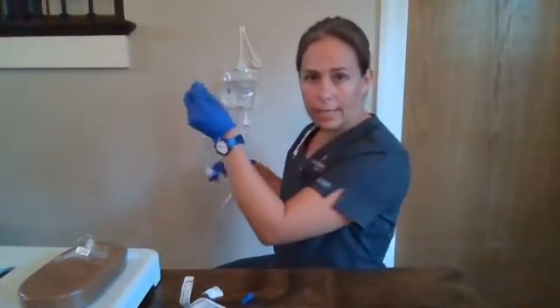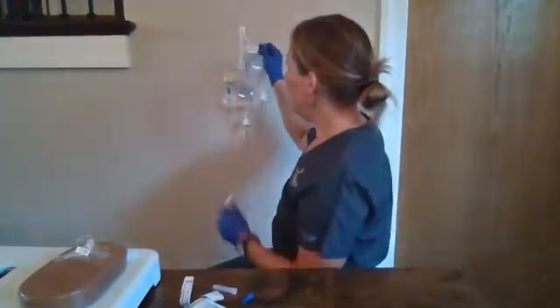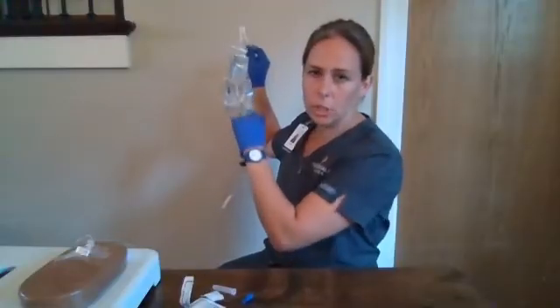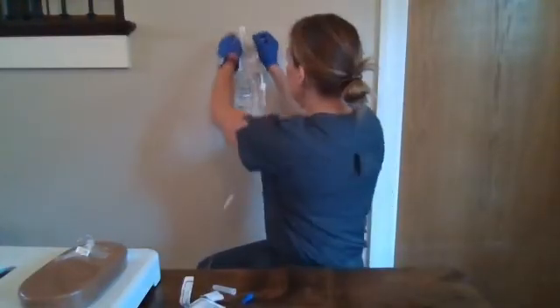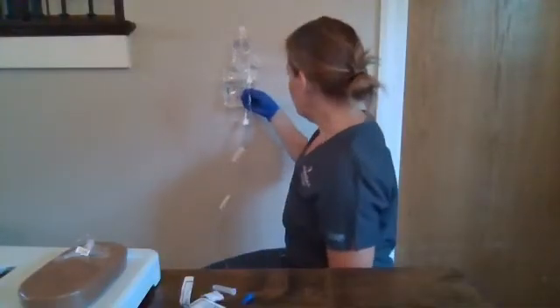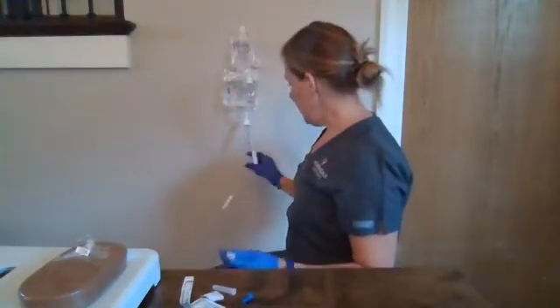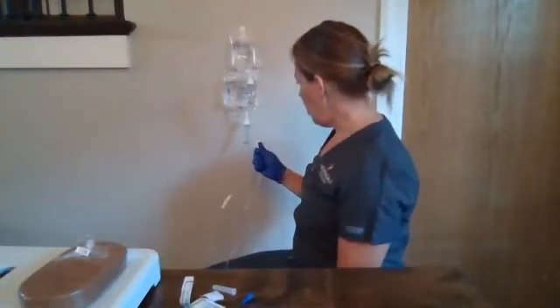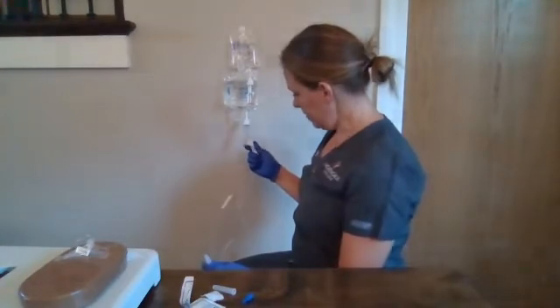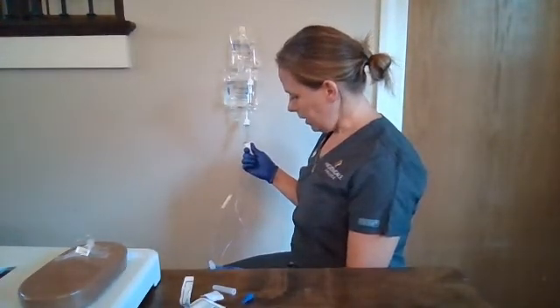We are going to hang this one above our primary, and again we're going to verify that both of our bags are at least 30 inches above our patient's IV site. We're going to squeeze our drip chamber to half full and prime our line by slowly opening up our roller clamp until no air bubbles are in the line.